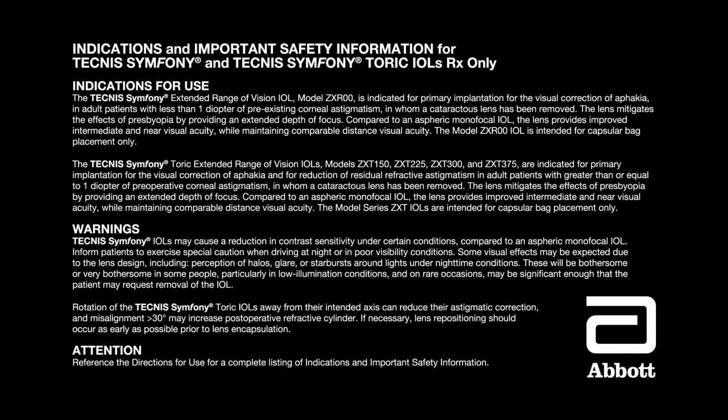The Tecnis Symfony Toric IOLs, model ZXT150, ZXT225, ZXT300 and ZXT375 are indicated for primary implantation for the visual correction of aphakia and for reduction of residual refractive astigmatism in adult patients with greater than or equal to 1 diopter of preoperative corneal astigmatism in whom a cataractous lens has been removed. The lens mitigates the effects of presbyopia by providing an extended depth of focus. Compared to an aspheric monofocal IOL, the lens provides improved intermediate and near visual acuity while maintaining comparable distance visual acuity. The model series ZXT IOLs are intended for capsular bag placement only.